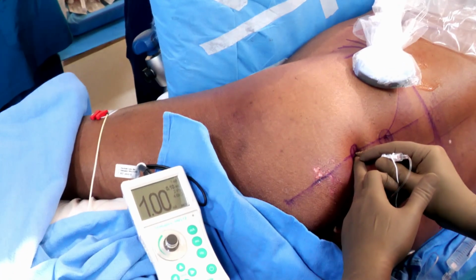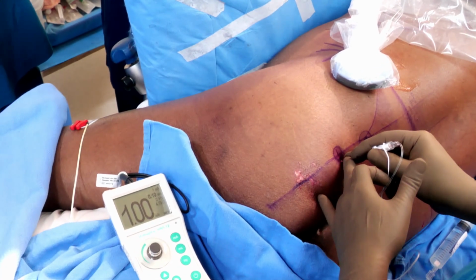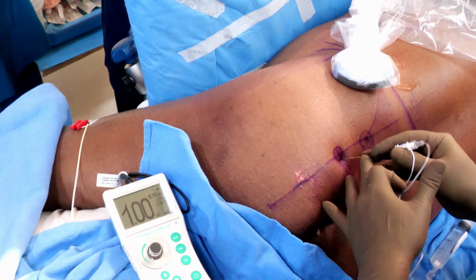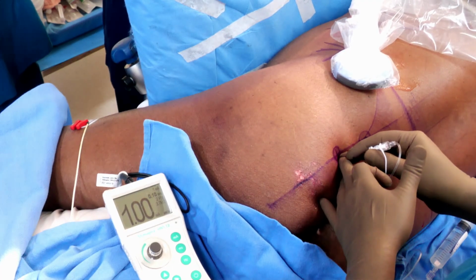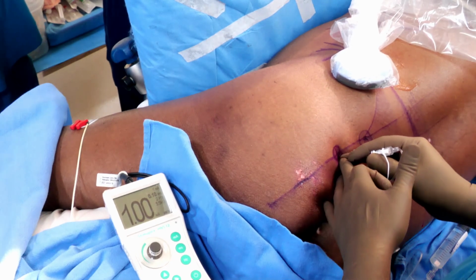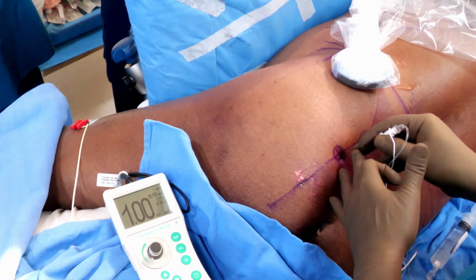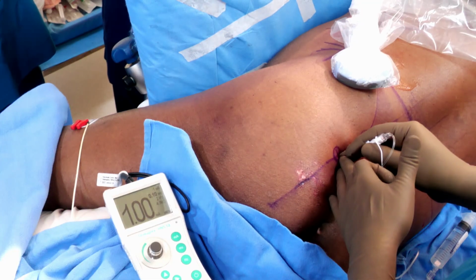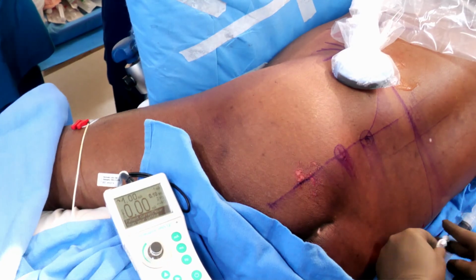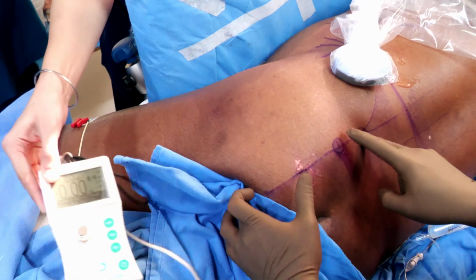These are deep blocks, and I think you have explained that this is not to be done in anticoagulated patients, patients who have got coagulopathy. A bit more caudal. And if you're not getting it, you have to reassess your anatomical landmarks. So probably you have not palpated the posterior superior iliac spine or the ischial tuberosity. More commonly, it is the ischial tuberosity which creates a problem.